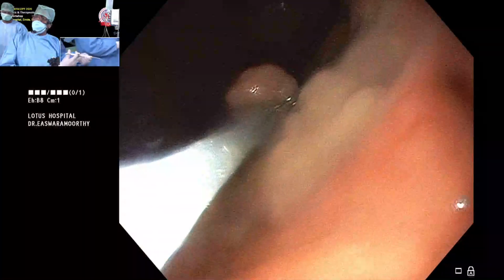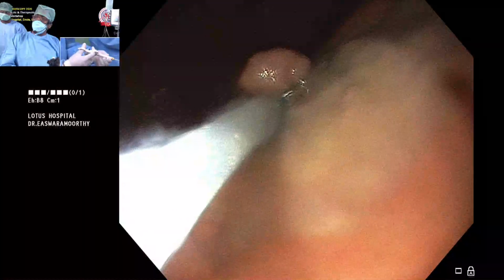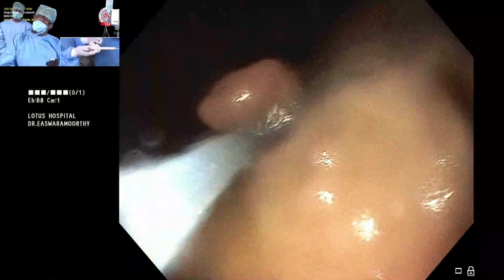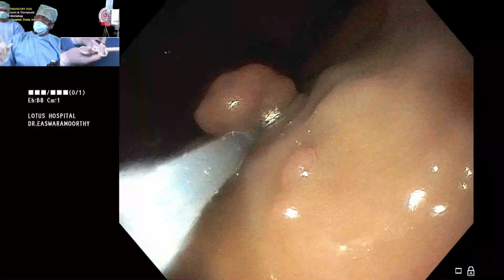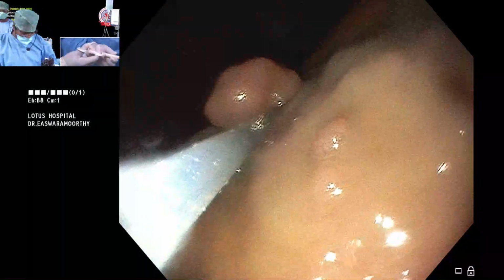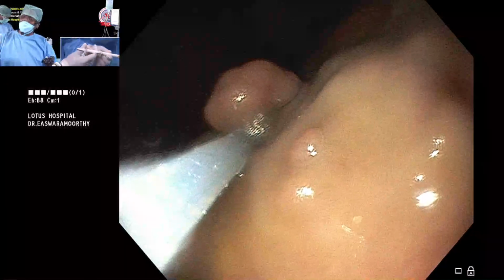So she is closing it, and she is telling me she can't see, so you have to tell her. Did you close? Then she is closed up to the mark. Now if she closes any further, it is going to cut through. Now I am going to use an endo cut. The two things you have to do.